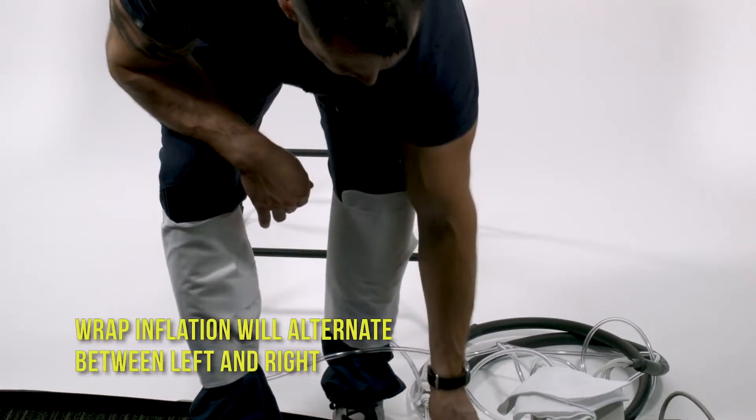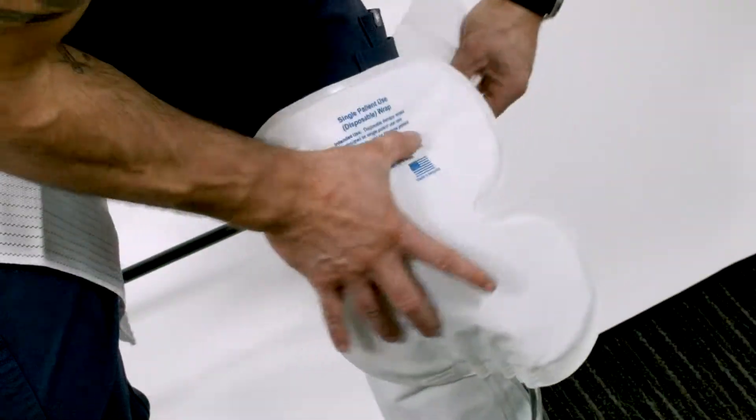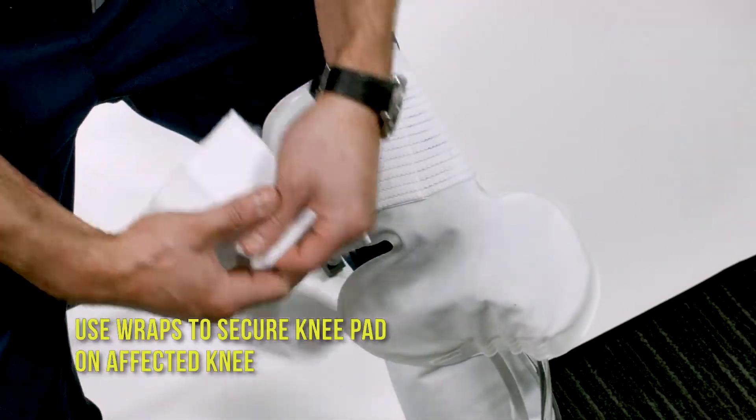Wrap inflation will alternate between the left and the right. Use the wraps to secure the knee pad on the affected knee.